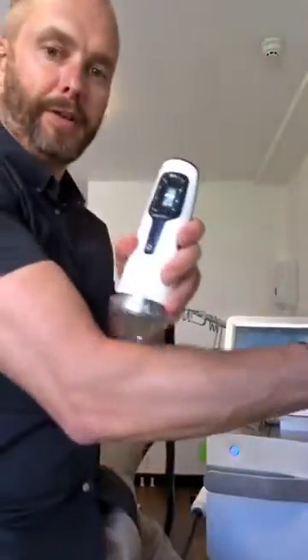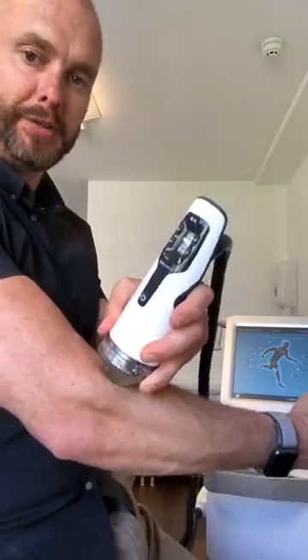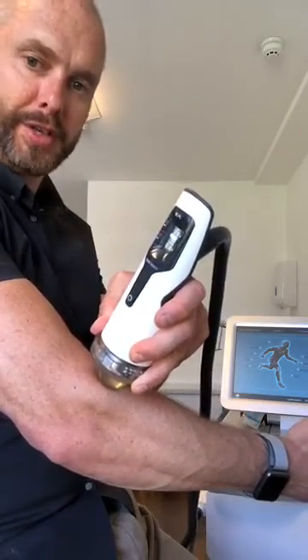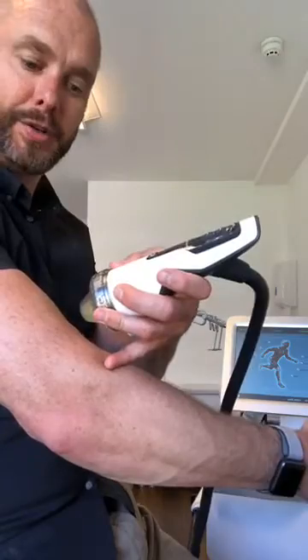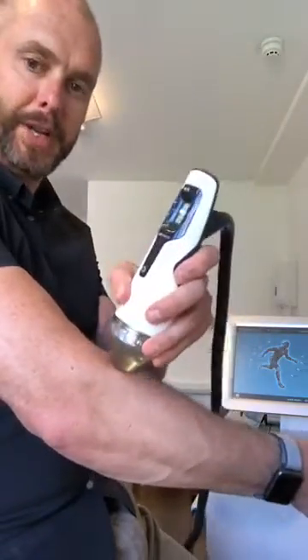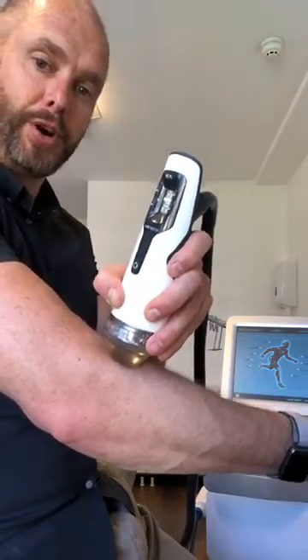When you use the focused machine, which works very differently, you don't really feel anything until the point at which all of the beams converge in that one spot — it's very focused on a very specific pinpoint. For example, if I was treating my forearm here using the standoff for something like lateral epicondylitis, you've got to go straight onto the tissue. I wouldn't really feel anything at the tissue at all — there'd be no sensation. But a slight move one way or the other in trying to find the point of most pain, and you could be off the target.